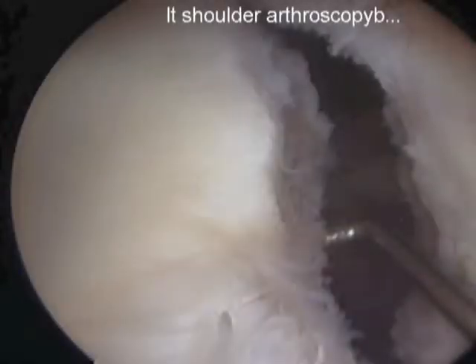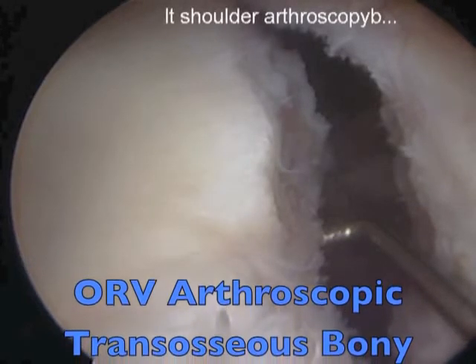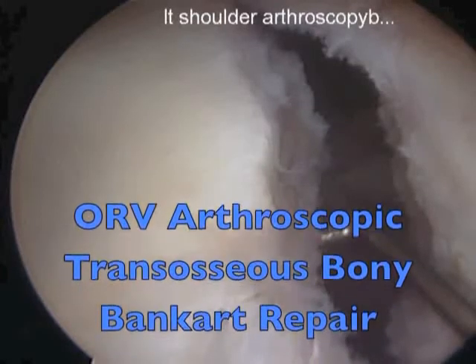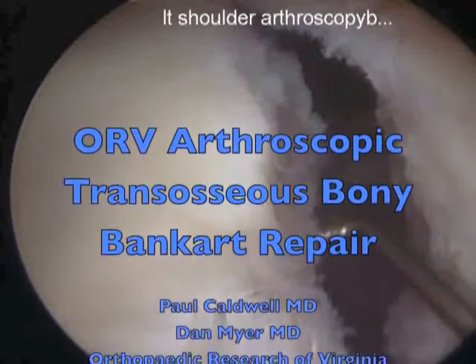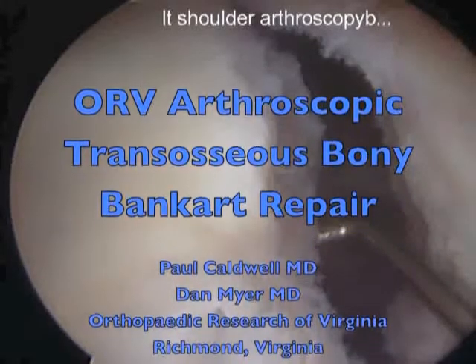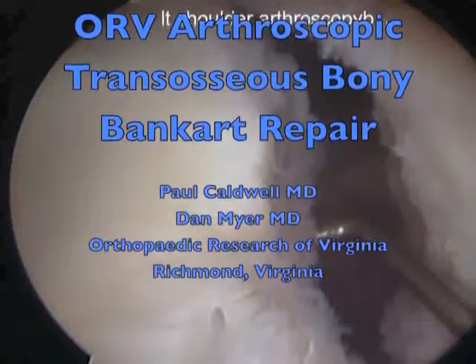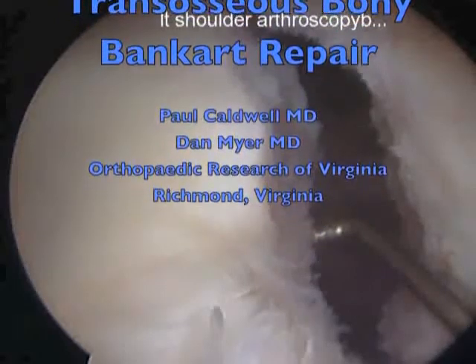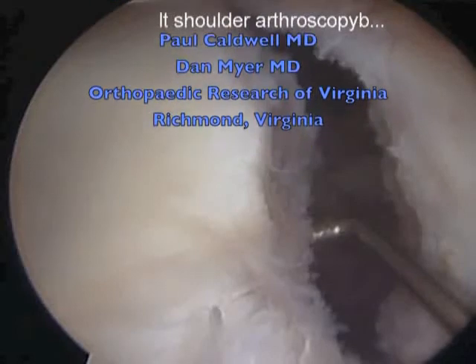Treatment of anterior instability of the shoulder is a controversial topic that often requires surgical intervention. Advances in arthroscopy have enabled us to better visualize and understand the pathology involved. We can now tailor our surgical approach to the degree of capsulolabral laxity, anterior bone loss, and the size of the Hill-Sachs lesion. We have learned that recurrent instability is directly related to the amount of anterior bone loss, and preserving bone is imperative in repair techniques.